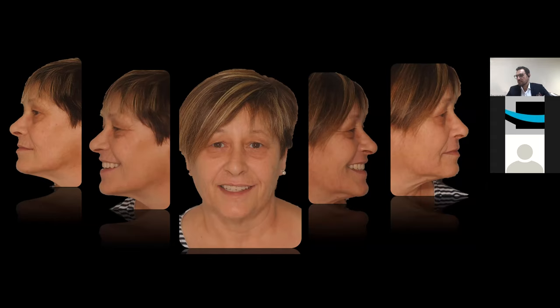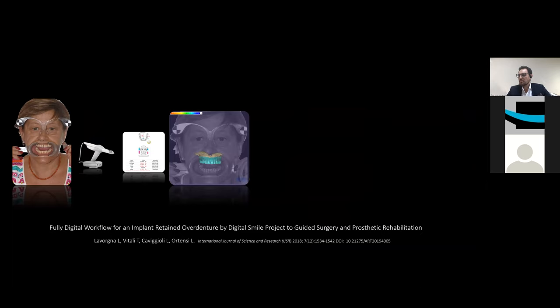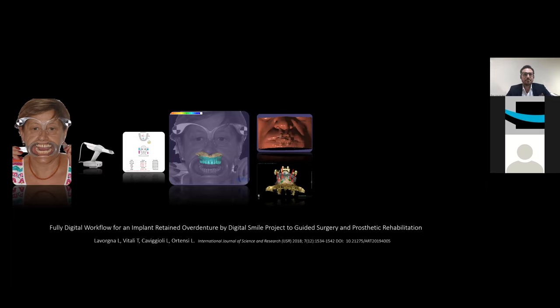And this is the entire workflow. I took two photos. I took a digital impression of the mouth of the patient. I did an electromyography exam. And I share all this information with my team, and in particular with my dental technician, so he can build a prototype inside a 3D software. I can check this prototype inside the mouth, and now I can transfer the whole information of this patient to Luca Lavorgna to have a CBCT with the final volume of the patient.